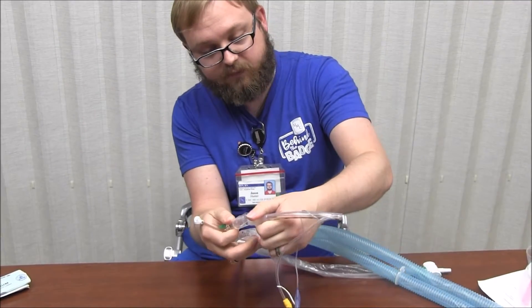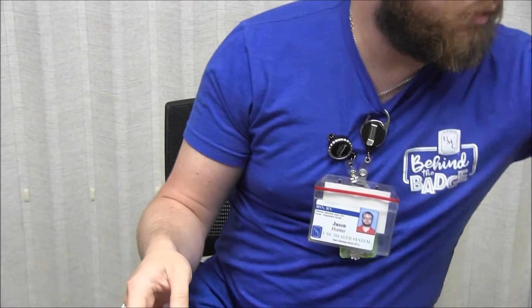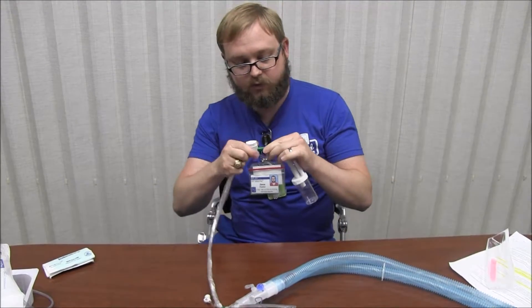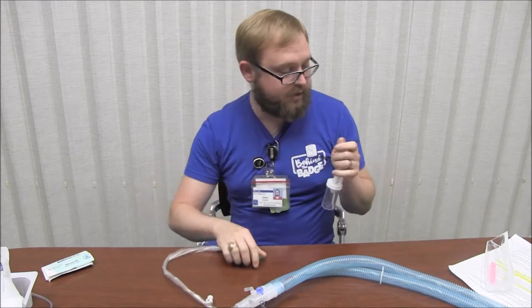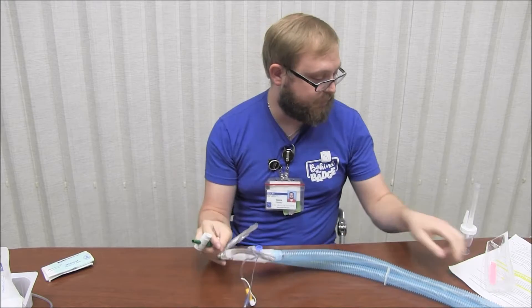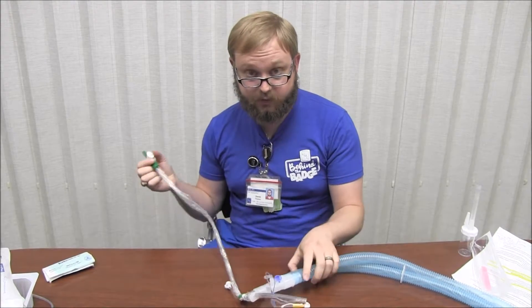You just pop the patient off the ventilator and change out the circuit. After you've gotten your new inline suction, you can go ahead and connect up to the lukens tube and connect your 10-foot long tubing to obtain your sample. After you've obtained a sample, or anytime you've suctioned your patient, we want you to completely clear the inline suction using those pink bullets. We also want you to clear it all the way to the suction canister through the 10-foot long tubing. If your suction canister is getting full, go ahead and change that out.